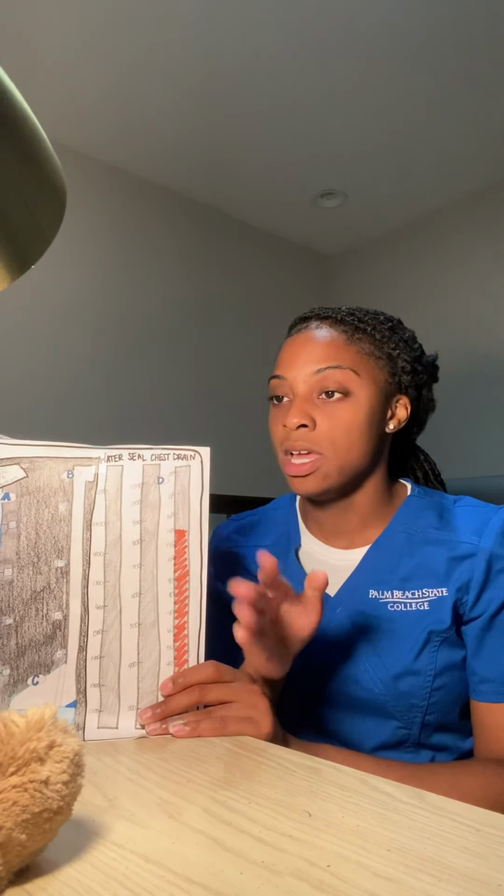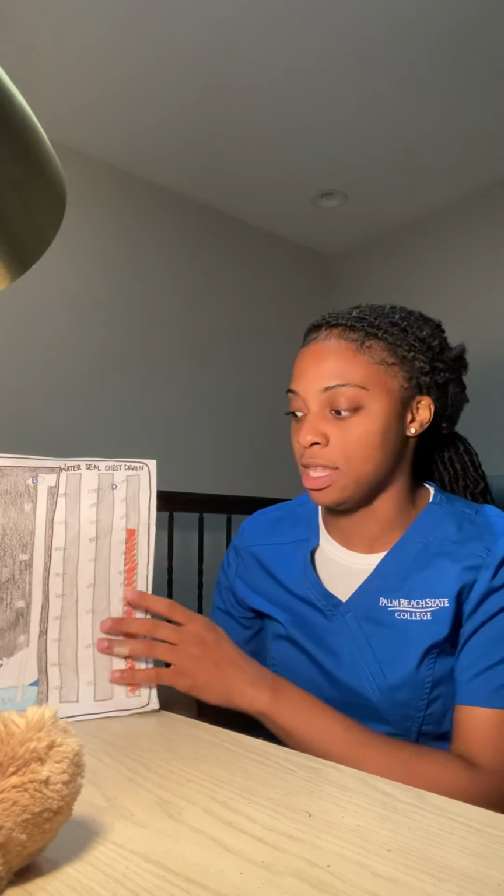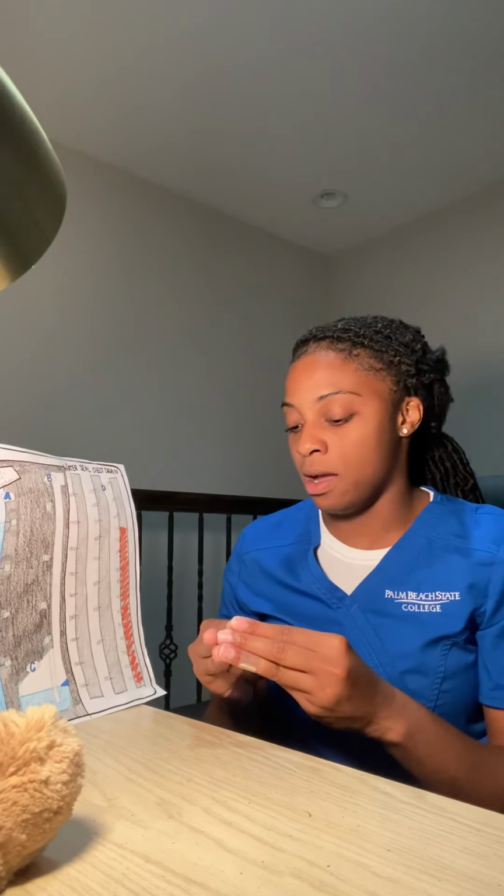So we're maintaining our patient's chest tube. I just got on shift, so I'm going around checking my patients, doing my rounding, getting a report on all of my patients. So I see that my patient has a chest tube, so I'm going to go ahead and assess the chest tube as the first thing that I need to do. I'm going to perform my overall head to toe assessment as I would on any patient, but I would listen to their heart sounds, and I would do a lung assessment, and those would be the most important that I need to do.